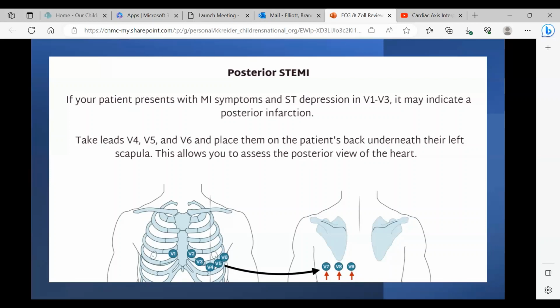So you notice V1, V2, they're right down in the sternum. Sometimes that can be kind of hard to find because you can't really feel your ribs in the upper part. What we can do is use that little notch you feel right above your clavicles, right in between. If you feel down just a little bit, see where that kind of square part of your sternum is, that's your manubrium. That ridge, right where that little skinny part almost looks like a necktie, with the knot of that necktie and the long part come together, you can feel that ridge. You go over to the side just a little bit, that's your second intercostal space.